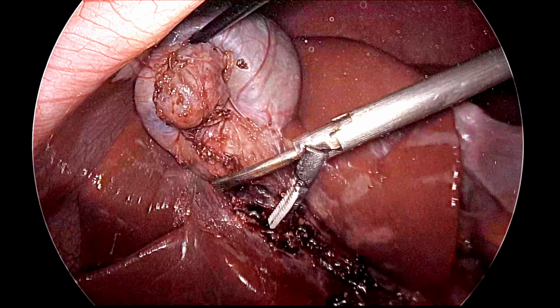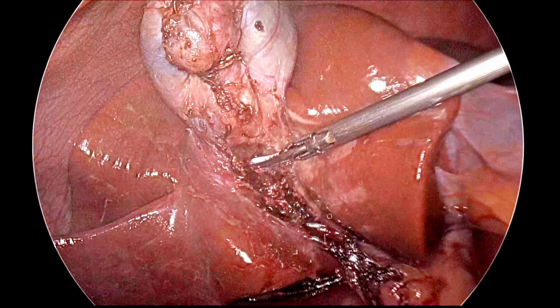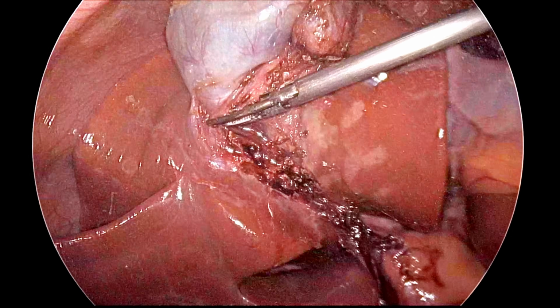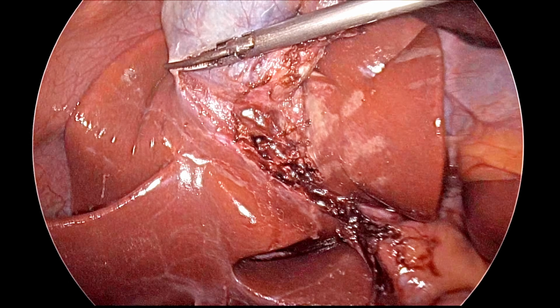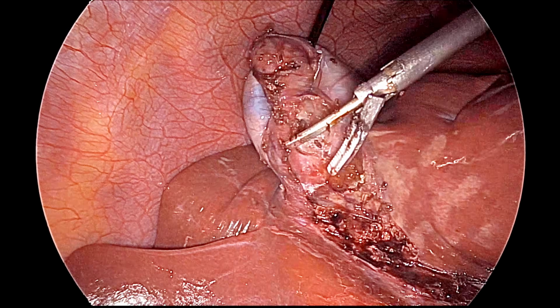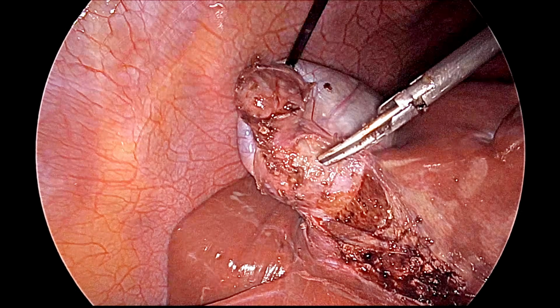And slowly it is getting separated. Compared to the simple cholecystectomy, here the size of the cystic duct was a little smaller. So that is why compared to the other surgery it was a little more difficult, but you can easily perform it, and harmonic or LigaSure, both you can use for clipless cholecystectomy.